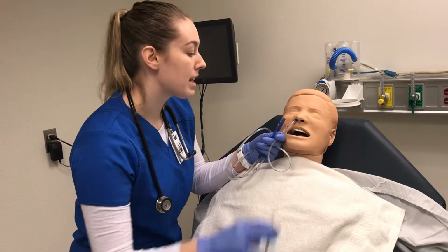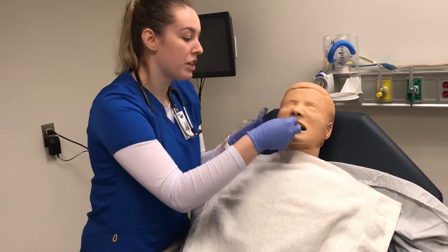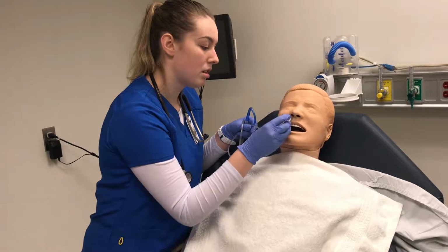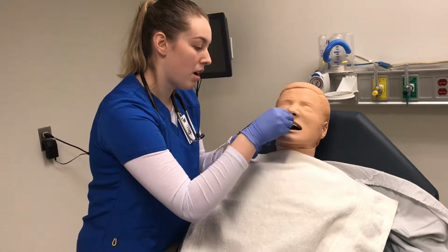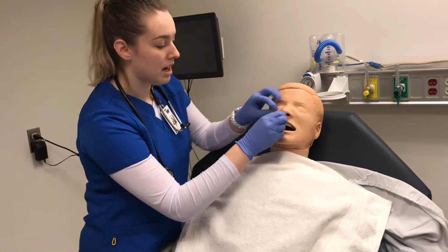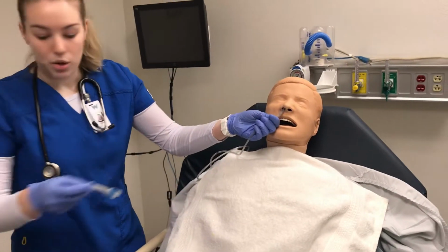And Shirley, I need you to take a sip of ice water. Good, okay. And I'm going to tell you to swallow, and each time I'm going to advance the tube. Ready? Swallow, swallow, swallow, swallow. Keep swallowing. Good, okay. So now the tube is all the way in.